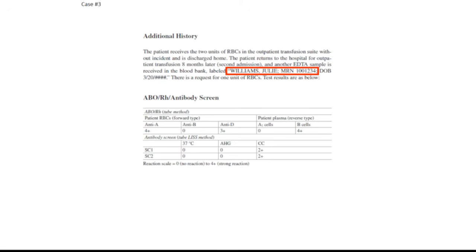So that's similar to what we had before. She's an A positive patient with antibody screen not reacting on screening cell 1 and 2. Correct. So as we've been previously describing, again, the anti-A reacts strongly with the patient's red cells, negative with the B. In the plasma, we see antibodies to B cells and reactivity with the patient's red cell with the D antigen.